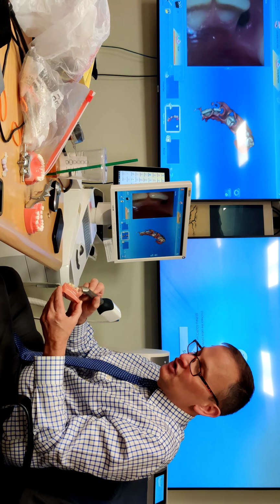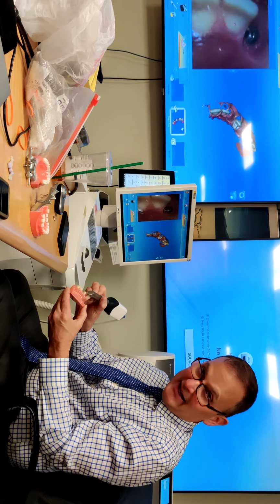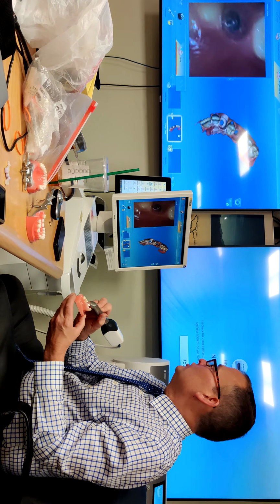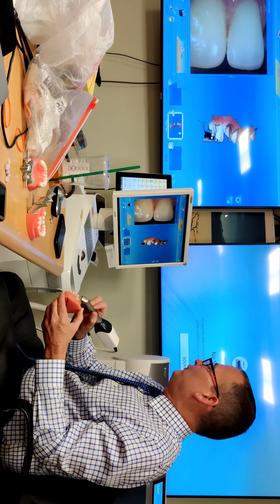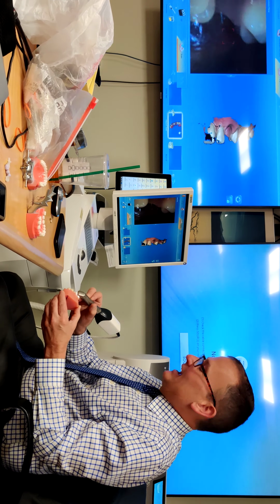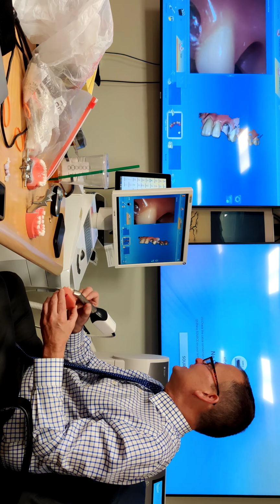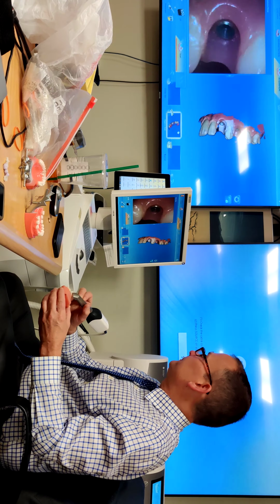Historically, everybody, look, do you see how it has trouble on incisal edges? The Prime Scan doesn't have trouble with incisal edges. So go back to the premolar, then come down, and then come forward. Again, it's the lack of data on the incisal edge that gives it a problem, but Prime Scan takes care of that. Don't waste time. Do you see how quick?